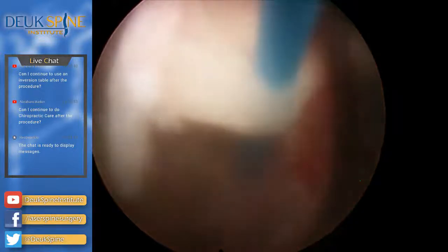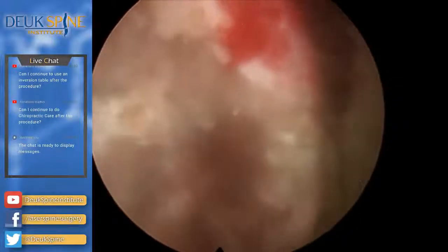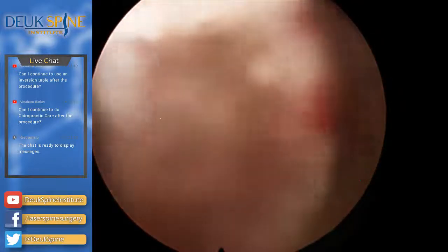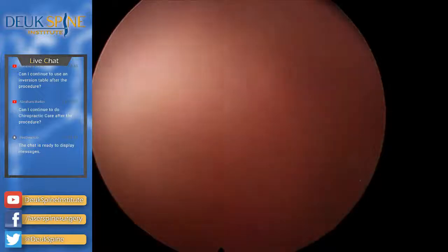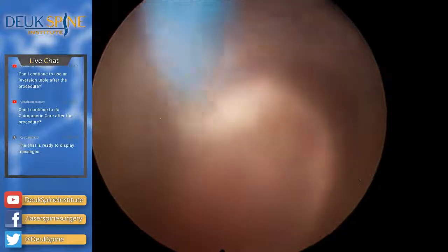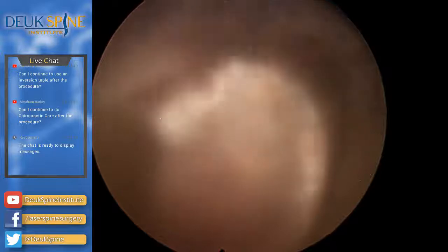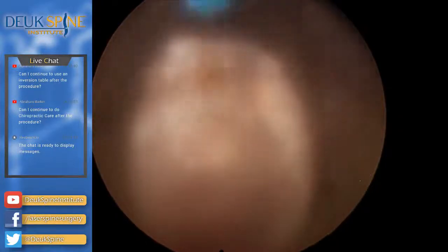That's just some fat. I know it's hard to see, and I apologize, folks.